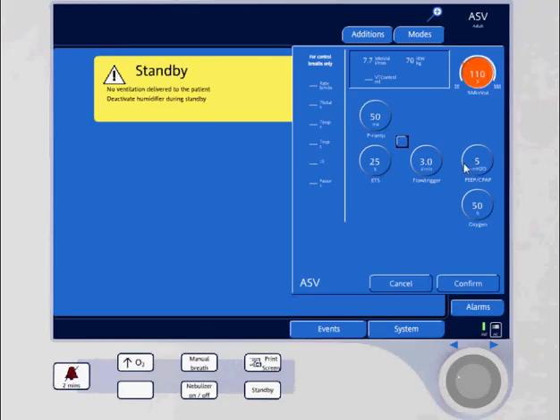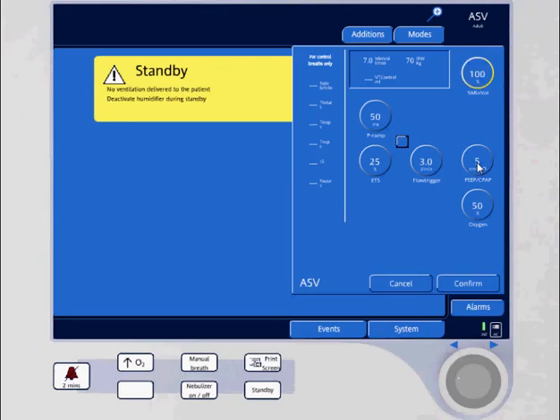First, I select a percent minute ventilation. My patient's a normal patient with no pathology, so I want the ventilator to provide 100% minute ventilation support.